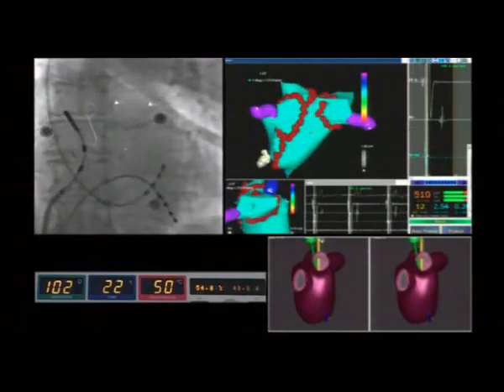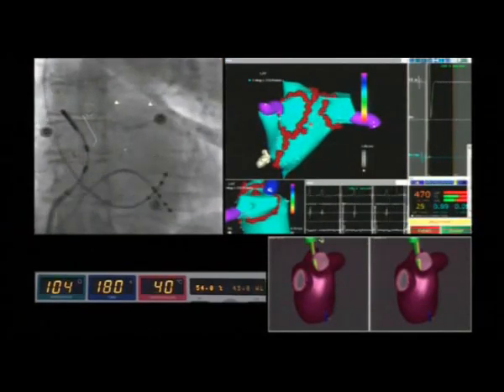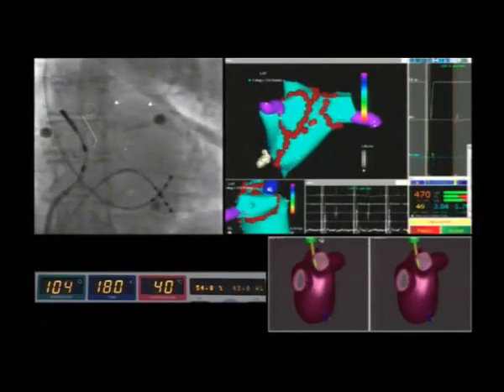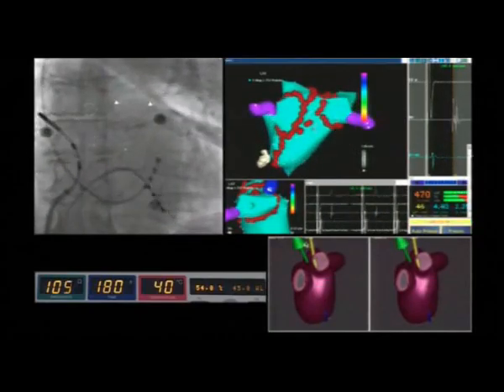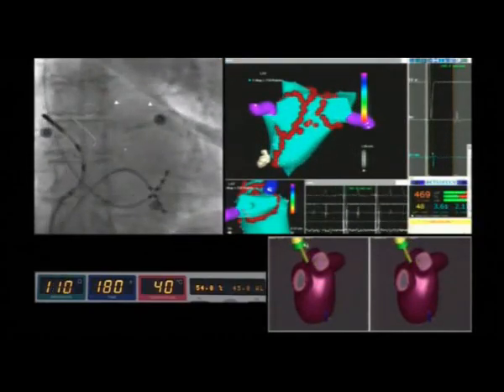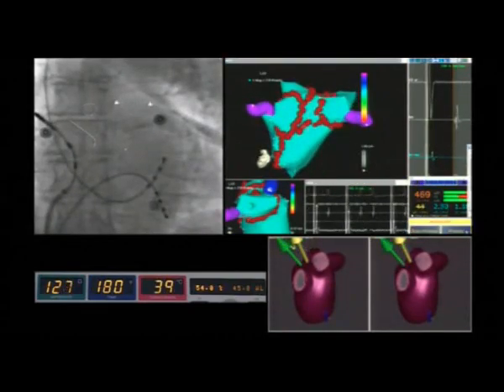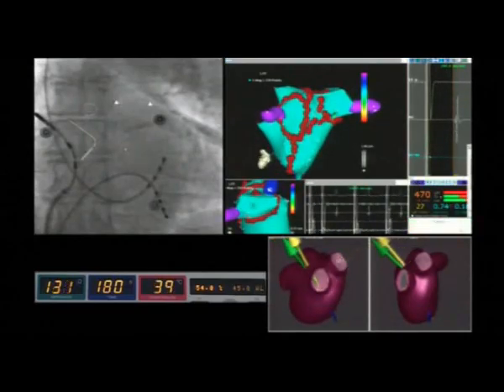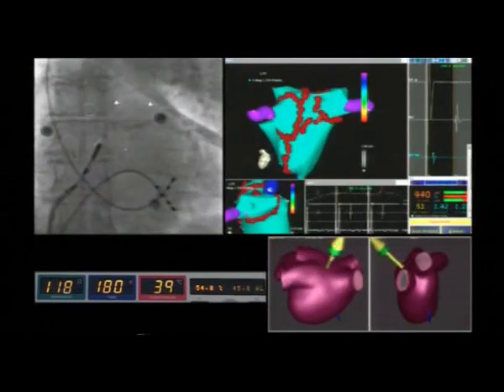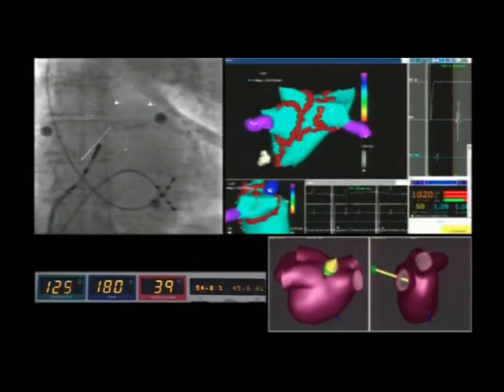The operator is performing a posterior lesion connecting the two encircling lines. This is done in order to prevent macro-reentrant post-ablation atrial tachycardia, like the mitral isthmus line performed at the beginning of the procedure. The additional lines in the posterior wall and in the mitral isthmus prevent possible post-ablation macro-reentrant tachycardia and increase the substrate modification area by involving not only the pulmonary vein area but the posterior wall as well.